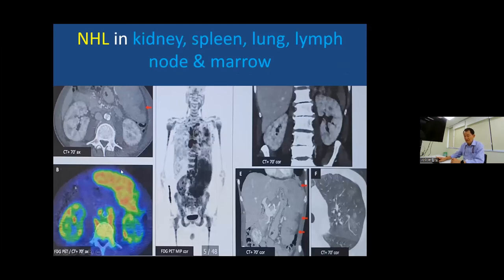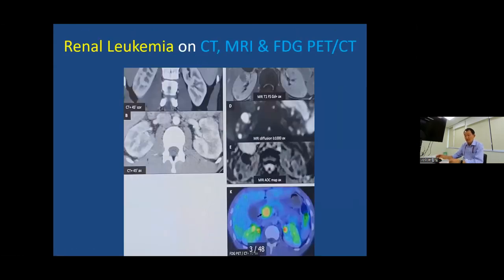And for any bulky tumor in the retroperitoneum or kidney, you must always think about lymphoma, non-Hodgkin's lymphoma here. The kidney can be involved by diffuse lymphoma. Leukemia can also involve the kidney. It's a little bumpy, with multiple decreased signal mass lesions. It's bilateral, infiltrated by leukemia or lymphoma, that kind of thing. And the retroperitoneal lymph nodes certainly are involved.